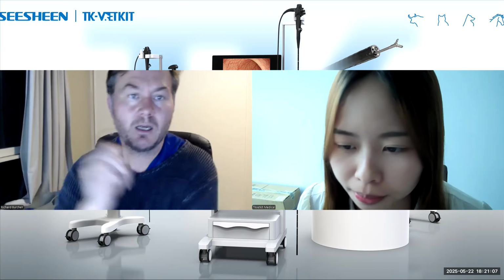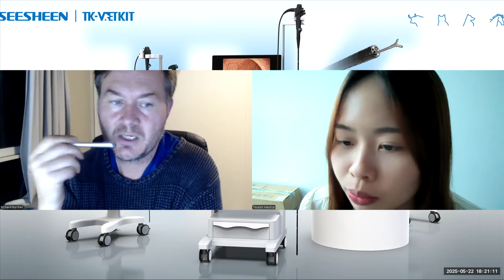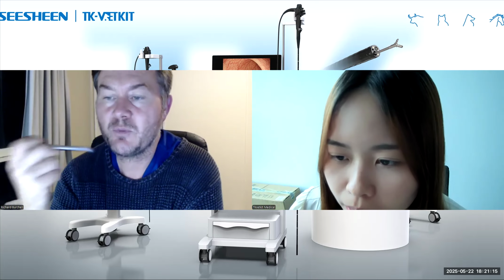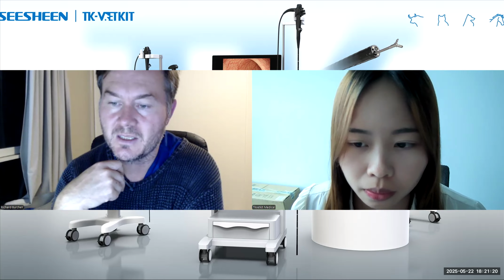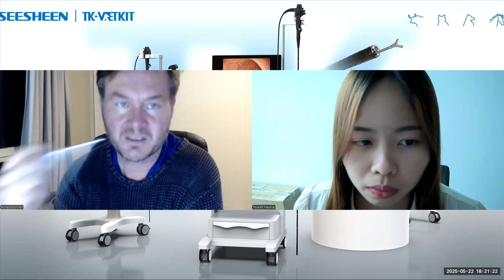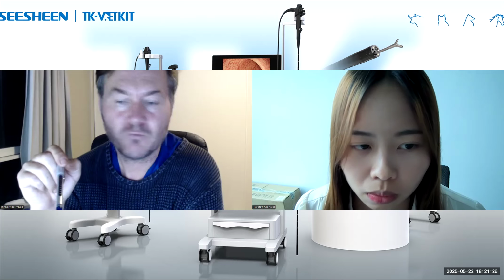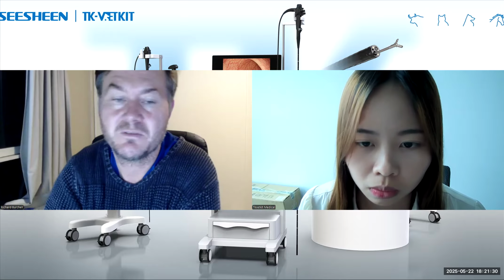Yeah, I think I answered that one, which was that obviously I don't scope large animals, but the principle is just how big your scope is. So if your scope is occluding more than 50% of the trachea, so that it's going to be difficult to breathe past it, then I think you do need oxygen. But if you've got a scope with plenty of room around it that the animal can breathe in, then I don't think that oxygen is imperative.